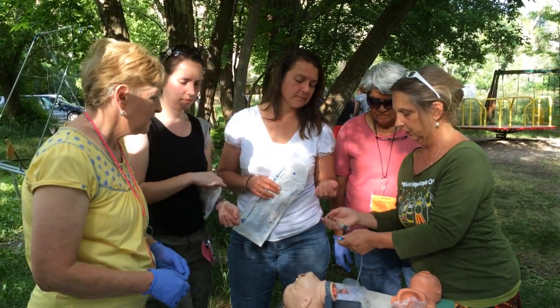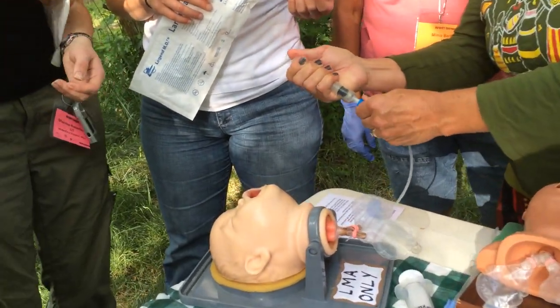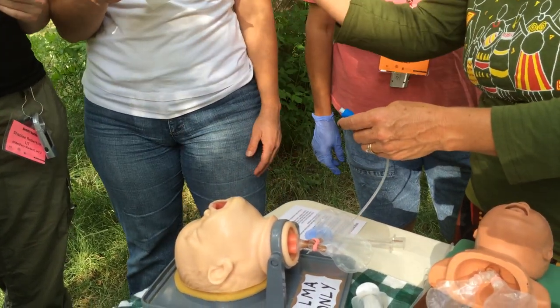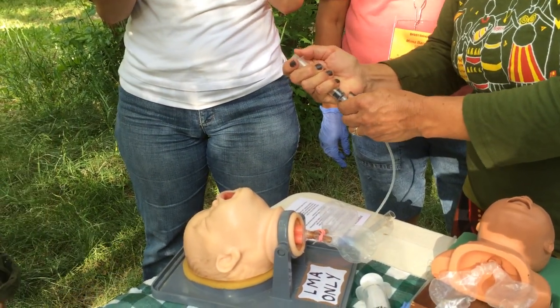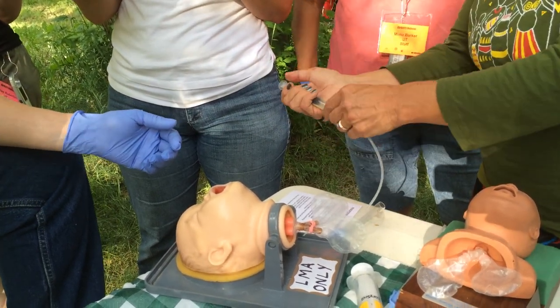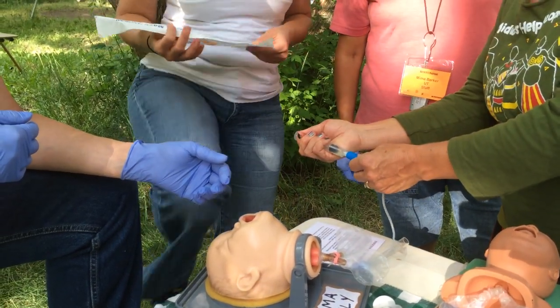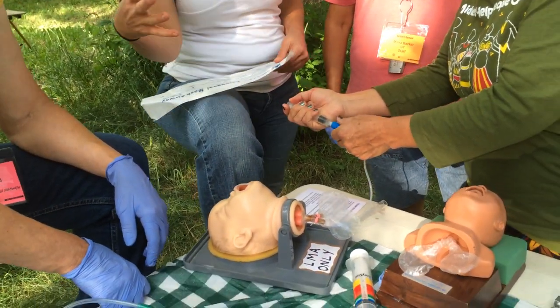How you tell is by making sure it's full of air just like when you got it. Or you can read the fine print on the package. It'll tell you how much it's supposed to hold. I think it's four. And write it on the outside of the package in bigger print so you're not searching for that information. If it's full and you take the air out, then that's how much was in it. You need to take a syringe. Right, but with the syringe you can push air out of it unintentionally.